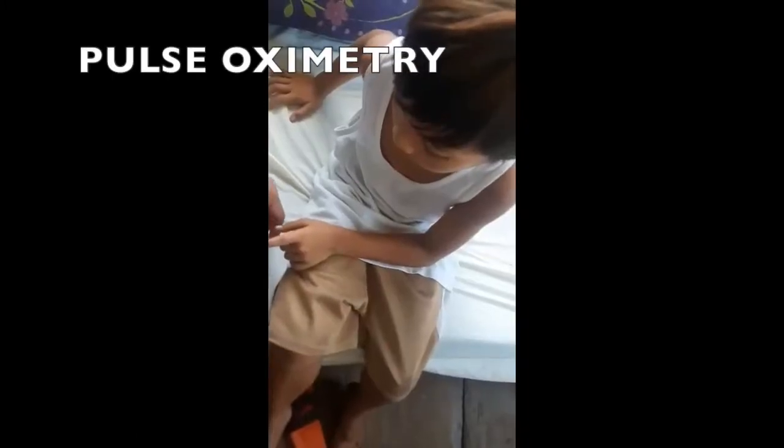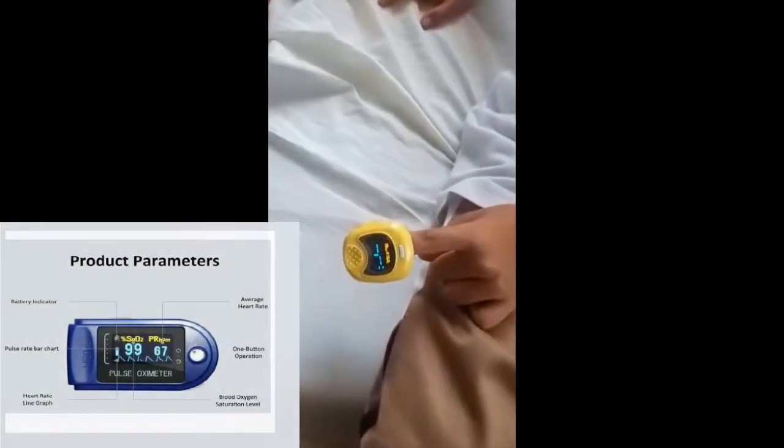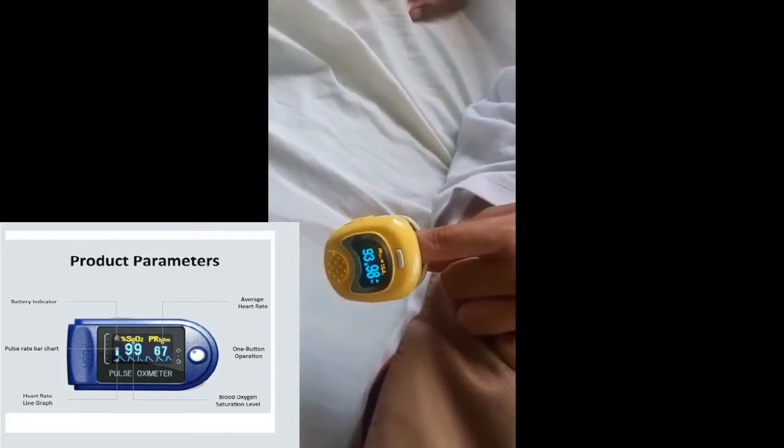Place the pulse oximeter on the finger of the patient. Make sure that the probe is well positioned on the finger, not too tight or not too loose. Oxygen saturation is lower in the immediate newborn. Beyond this period, an oxygen saturation of less than 90 to 92% may suggest a respiratory condition or a cyanotic heart disease. Measurement of the pulse rate is also noted.